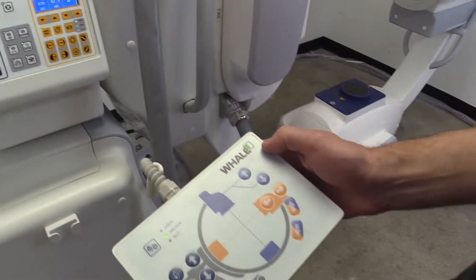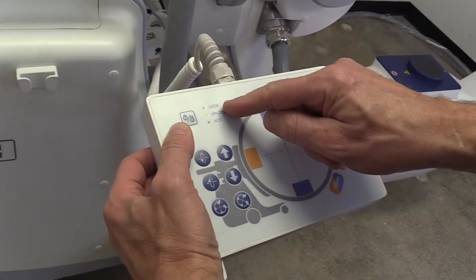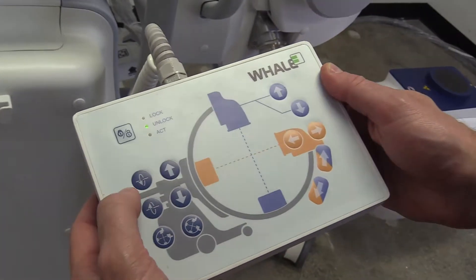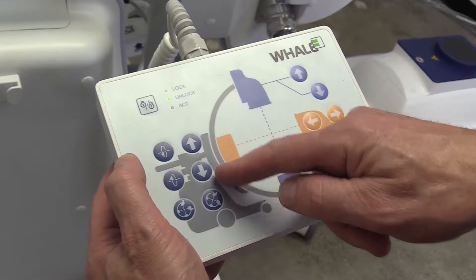The remote control can be attached to either side of the G-ARM. For safety, the remote will auto lock after a few minutes of idle time. Press the unlock button at the top left of the remote.